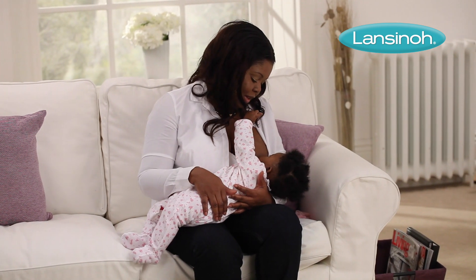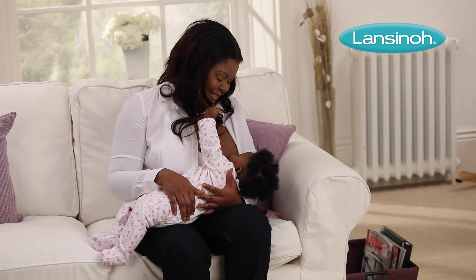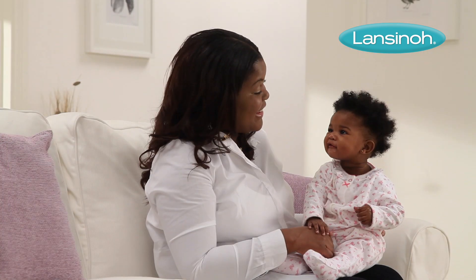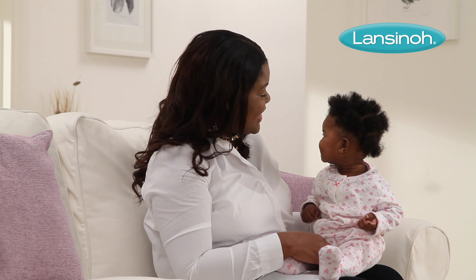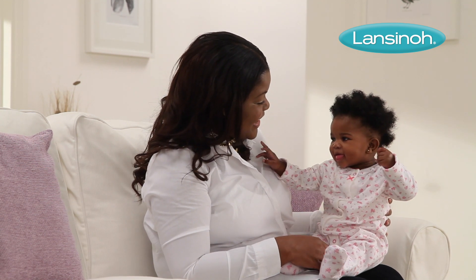Ideal for mums who express regularly, the single electric breast pump is easy to assemble and comfortable to use. It has two separate phases which mimic baby's natural sucking pattern, helping you maximise milk production.